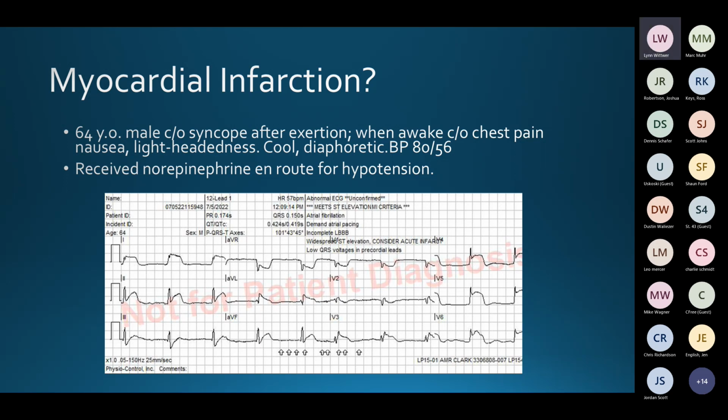Now, your machine is reading him. The machine, in this case, says meets ST elevation criteria. In this case, it's right.